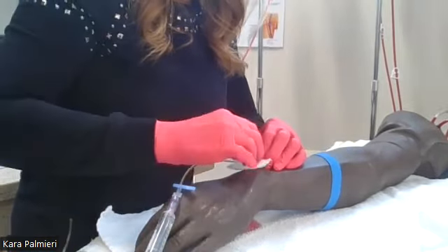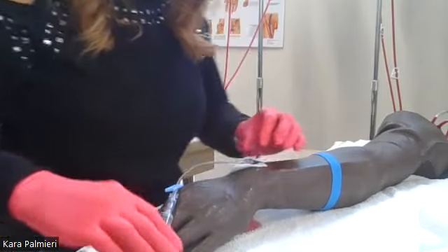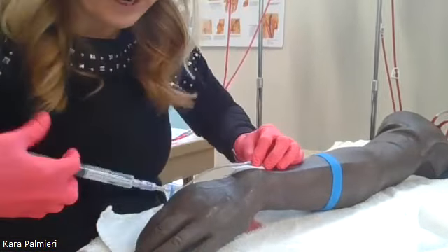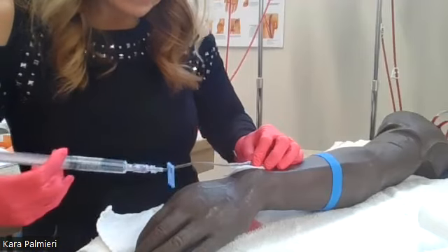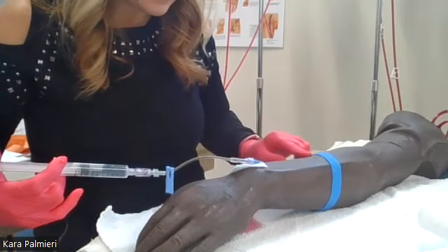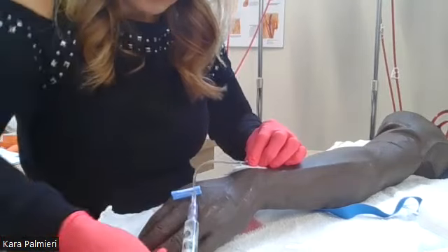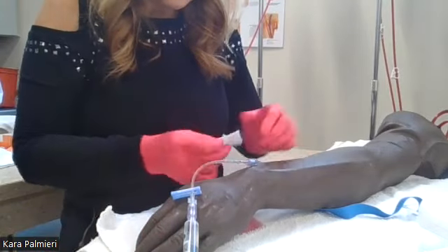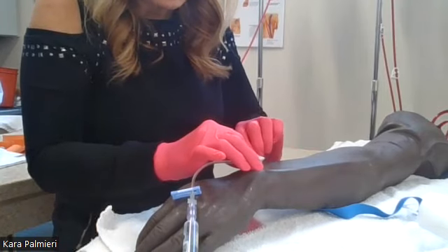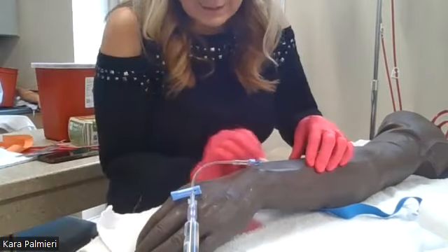Okay. I'm just going to clean up my mess a little bit. And I do take a towel with me, because when I get them, FYI, I used to be really good at IVs. So when I would get them, they would bleed like crazy. I'm just going to give it a flush, and it flushes great. Okay. And I don't have to give it all the flush right now, just enough to help it flush in. If you need to advance it a little farther, sometimes that happens too. But I want to dry this off so that my tape sticks to it.